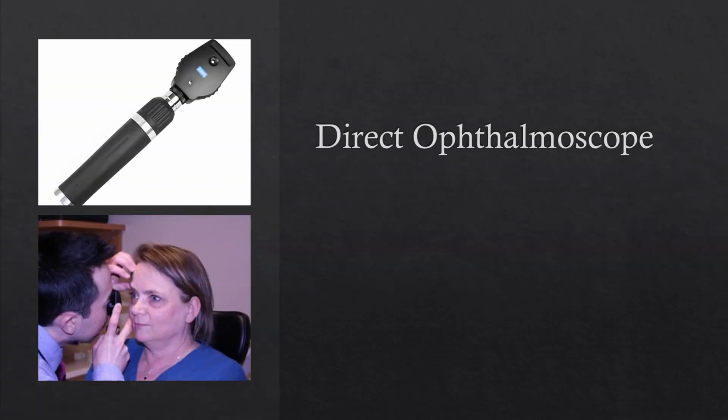Let's move on. The first method we have is the direct ophthalmoscope. It gives a magnified clear image of the fundus, okay? As you can see, the physician sits close to the patient and examines her fundus. It could be found in a non-ophthalmologist clinic. This could also be found in the neurologist clinic to see if there's a brain tumor causing elevation in the intracranial tension. This would lead to edema in the optic disc, and this is not our topic today, but the key point is that some systemic diseases cause effects in the fundus, and you could see them.